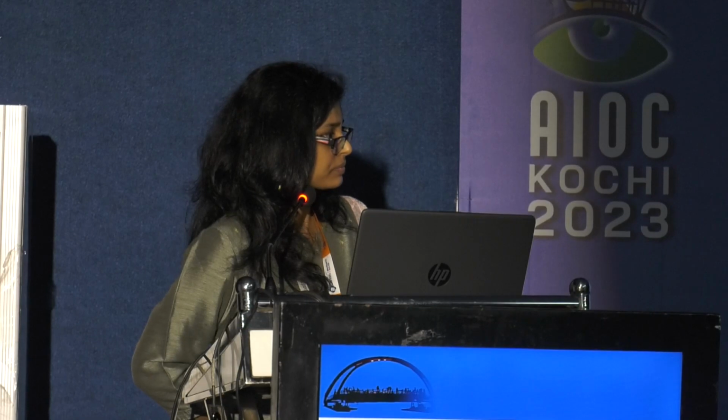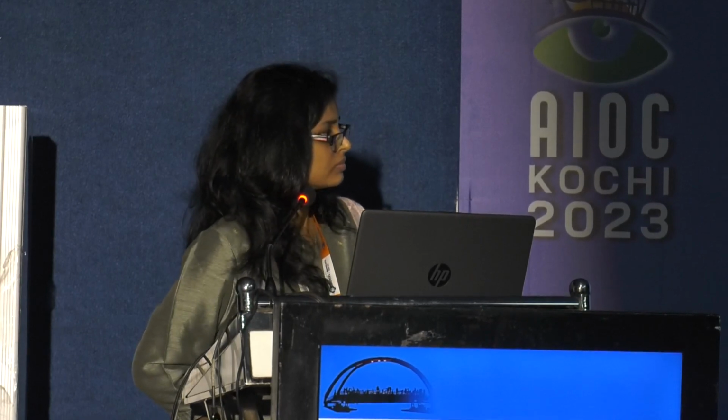There's also a technique called the spaghetti technique by the late Dr. Forlini from Italy, who was a regular in VRSI and many of our AIOS meetings. Like you do with spaghetti, you just roll it up, and I'm sure Sneha uses a lot of that too. Otherwise, if the position is such that you can't do a spaghetti technique because of restrictions of movement, you can always do a handshake technique, which is of course bimanual, and remove the subretinal band, which is going to save the day for you.